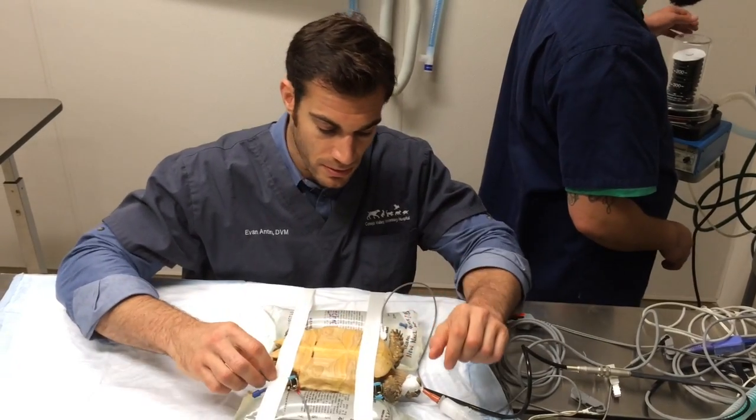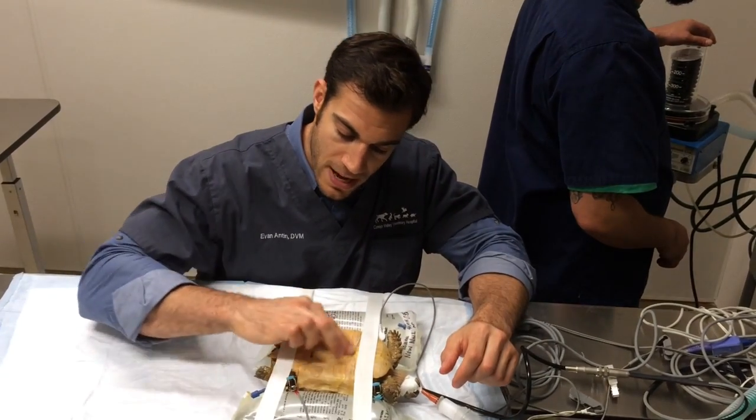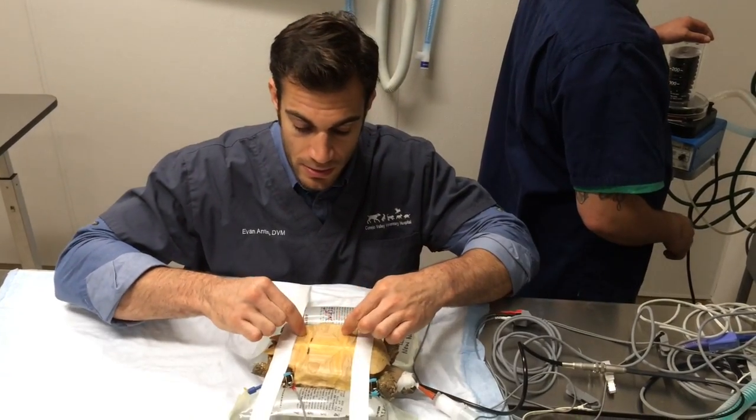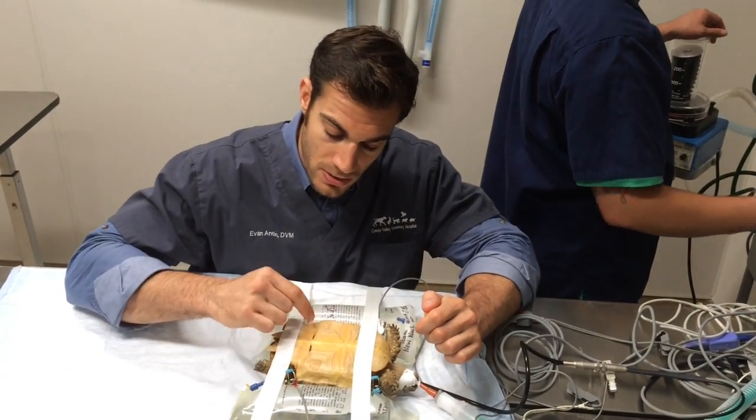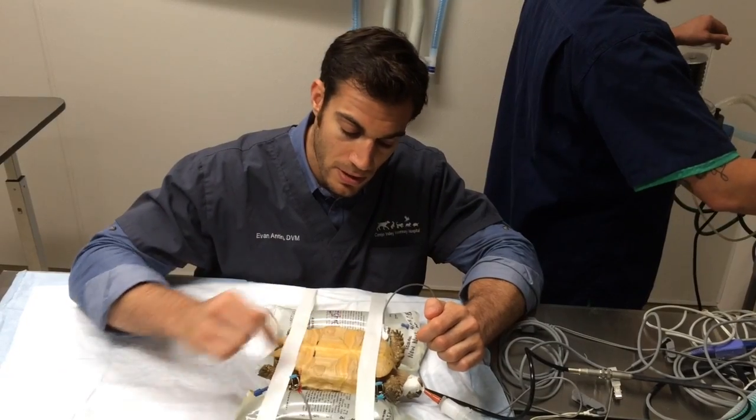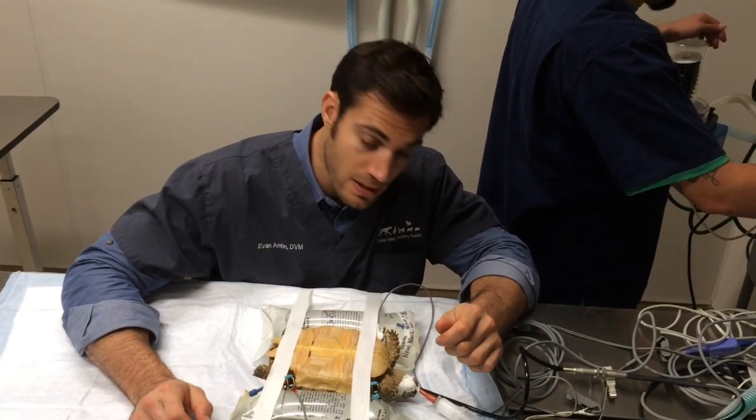She's probably about three or four years old, with a nice flat shell. We're actually going to go in right through the shell — that's our only option, unfortunately, in this case, to get these bladder stones out. So we're just figuring out exactly how we want to go in there and clean those out.